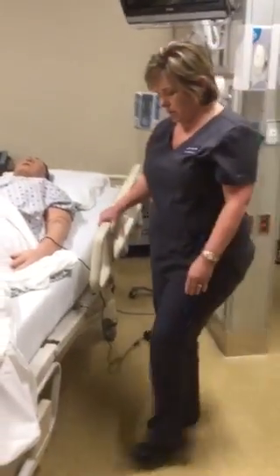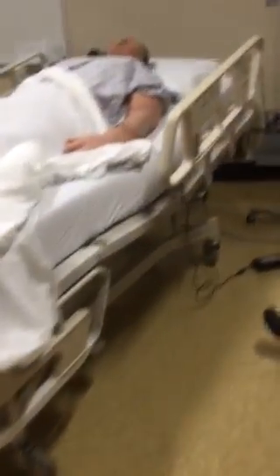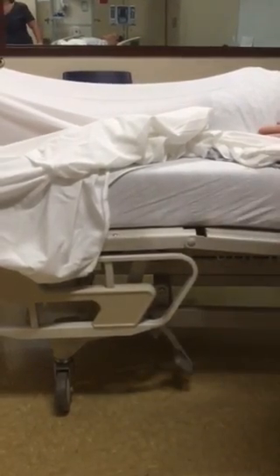Your brake is here, so if you were to need to move the bed, you would disengage the brake to the neutral or the steer position. Neutral is flat. It's usually the easiest way to move. And then you would re-engage the brake once you have the bed moved to the position that you need.